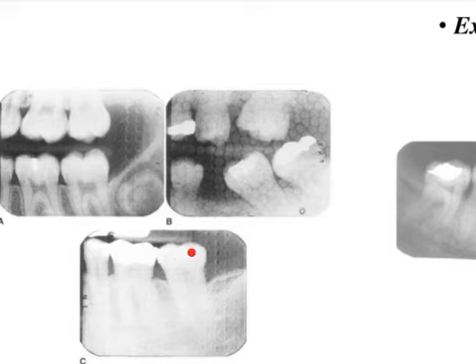Okay, so in case of herringbone pattern, you see this pattern is called herringbone pattern. It's there in the entire film, whereas tire track pattern is usually seen on two sides of the film. Here you are not able to appreciate the other side of the tire track, but at least one side you can see that it is tire track appearance and it is not there in the entire film.